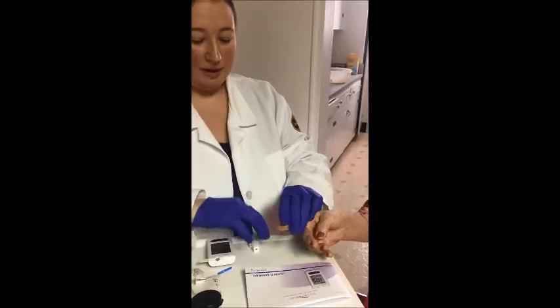Okay. You'd want to properly discard your lancet in a sharps container. If you don't have one at home, you can use a plastic bottle, but because this has a needle, you don't want to throw it directly in the trash can.